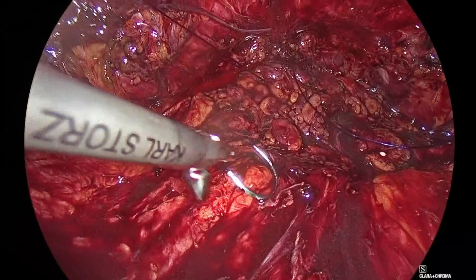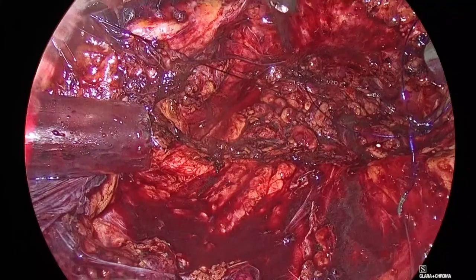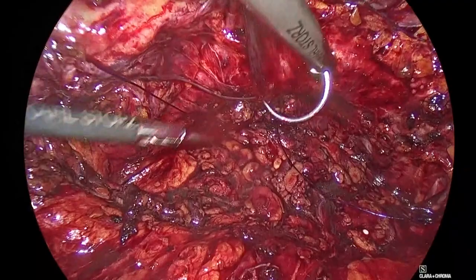Well, in this case, you don't need to reconstruct it, but there are other cases where you have a bigger opening. Show me the needle, Padeli, on the other side. Good, here. So the discussion about the era of robotics, we can be discussing until tomorrow. Certainly, I must say, pull, Panagiotis, go on the right side here.